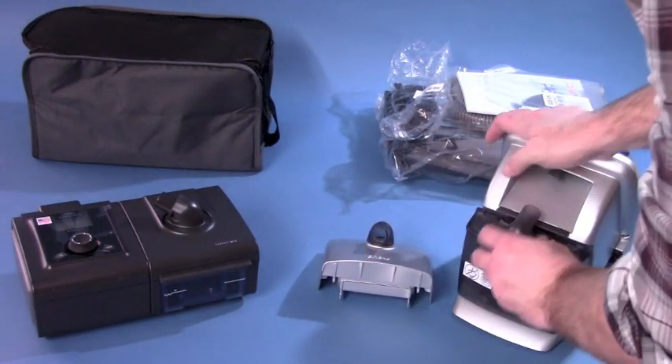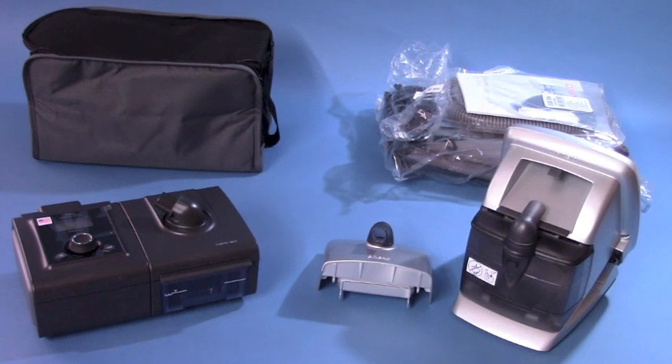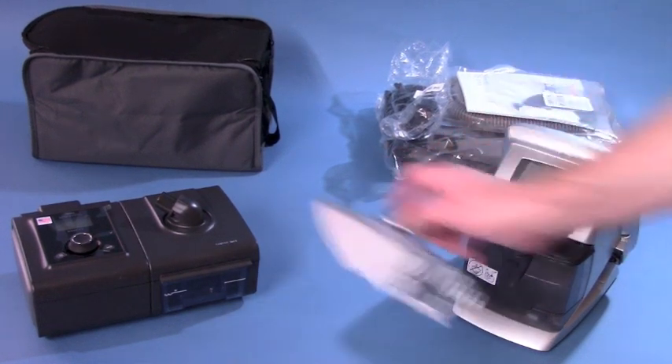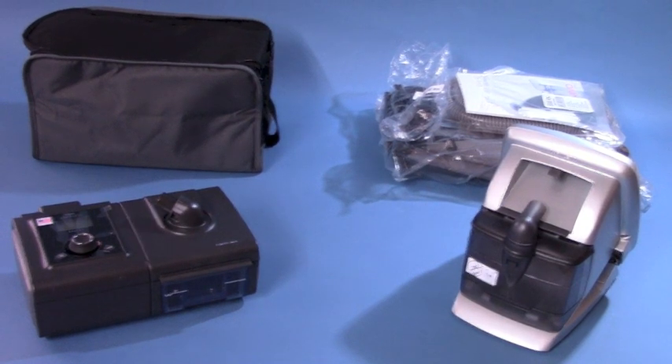Key features of the Vivo40 include user-friendly controls with large buttons and a backlit display. Enhanced dual mode provides the user with clinical and home modes for better therapy. E-Sync technology gives the Vivo40 the ability to match your breathing style for smooth support.